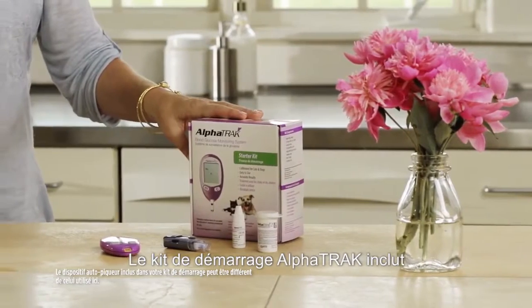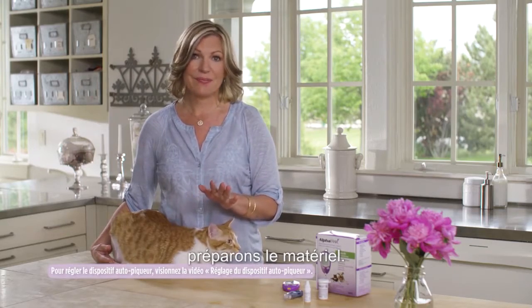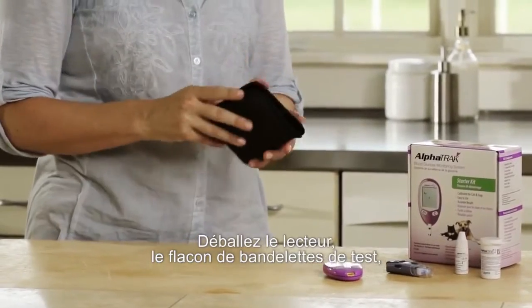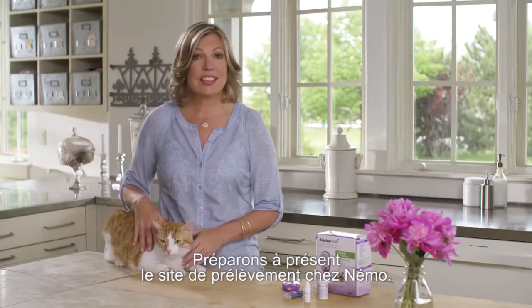The AlphaTrack starter kit includes everything you need to get started. Before we get to Nemo, let's get everything set for the test. Take the meter, test strip vial, lancing device, and lancets out of the pouch. Check the test strip expiration date. Now let's get to Nemo and get his test site ready.